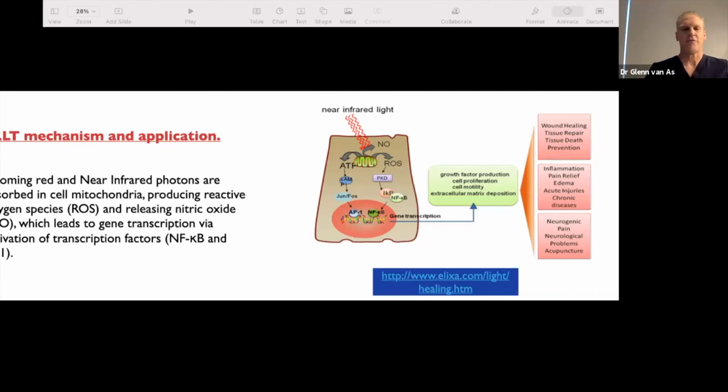So a safe setting is half a watt for 40 seconds for wound healing. And if you want pain relief, you need to use it a little longer. So I tell patients, use it for a minute to 80 seconds. Is it exact? No. If you want exact settings, you need to go and look at lasers that are intended exactly for low-level laser therapy.